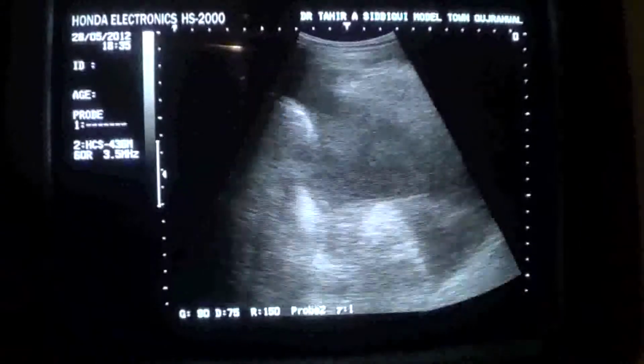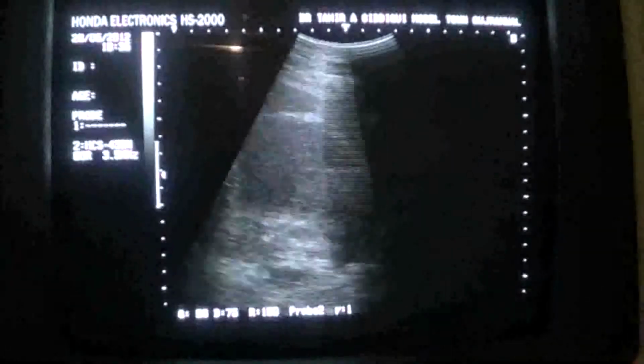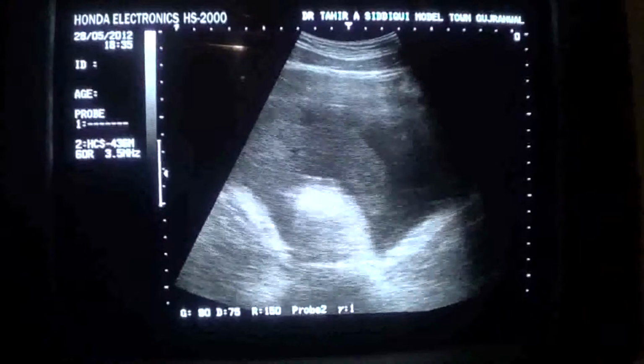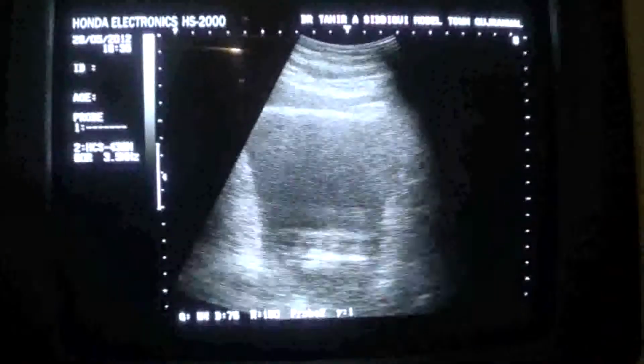Now I'm in the pelvic region. And you see how the bleed appears.